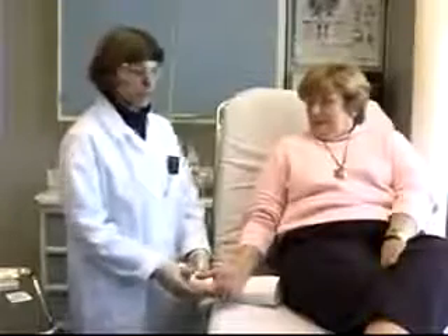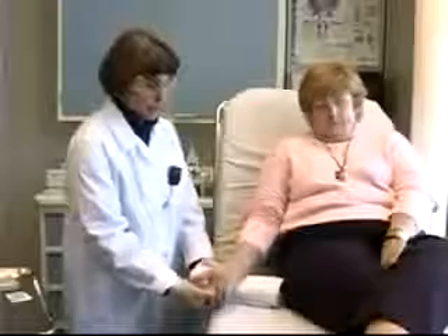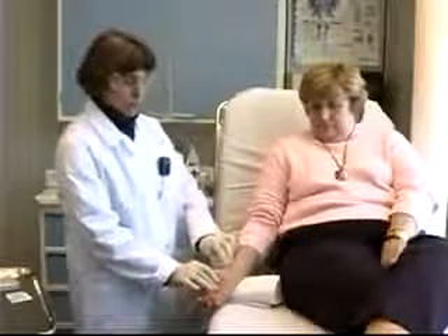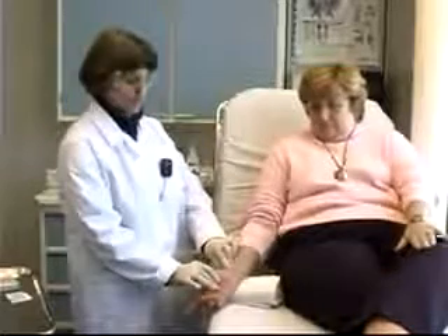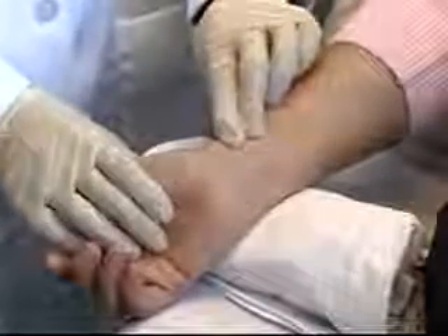I now have my patient seated comfortably on the stretcher. I'm going to tuck a rolled-up towel underneath her wrist. That will help hyperextend the wrist a little bit, which will bring the artery a little closer to the surface and make it easier for me to palpate that artery. I'm going to feel for the artery again — right there.